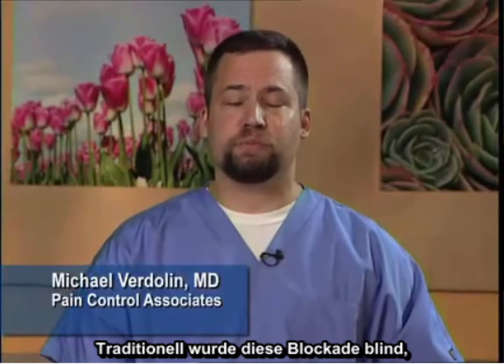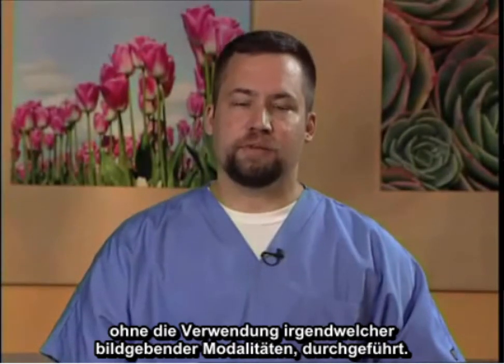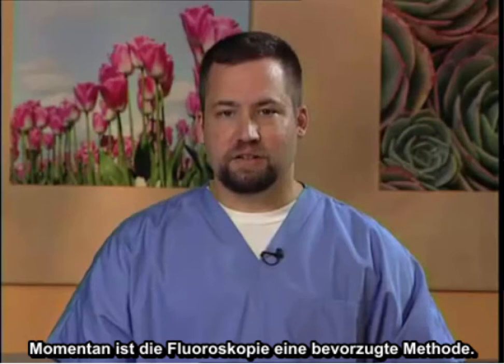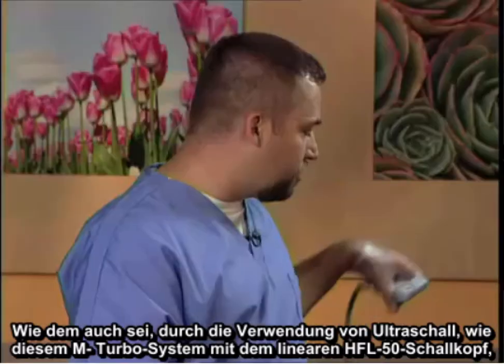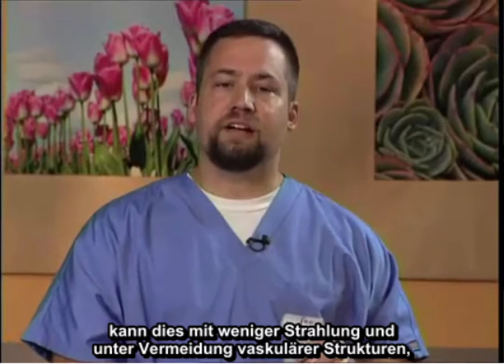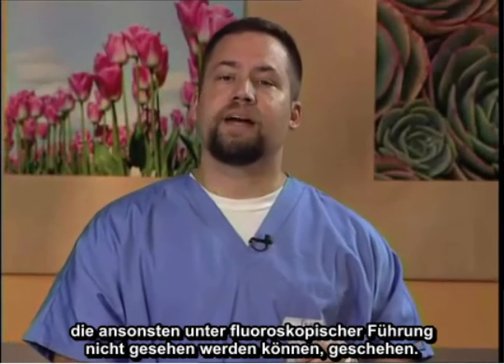Today, I'm going to demonstrate the stellate ganglion block performed under ultrasound guidance. Traditionally, this block was performed blindly without the use of any imaging modality. Currently, fluoroscopy is a preferred method. However, utilizing ultrasound — such as this M-turbo system utilizing the HFL50 linear probe — this can be done with less radiation and avoidance of vascular structures that might not otherwise be seen under fluoroscopic guidance.